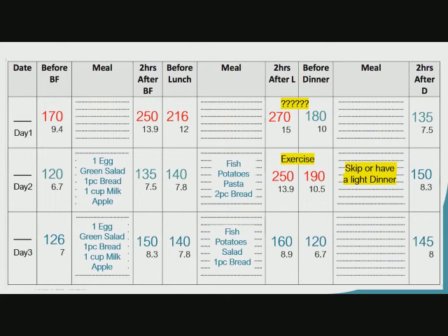And this is an example of how it goes, the process of adjusting diet and medications and giving some tips, and then a person can get full control of his or her blood glucose. But you see, the most important thing in all this table is the checking, the testing. The more you test, the more you know how your body interacts with different activities or diets.